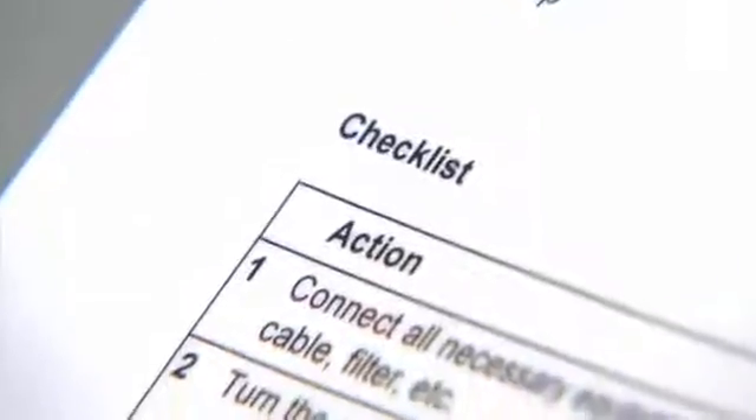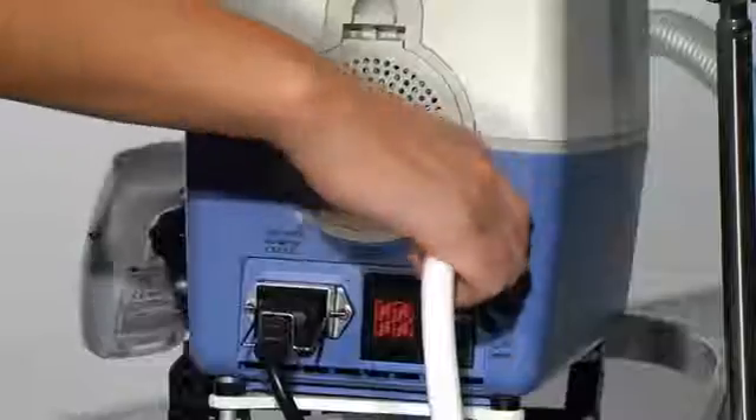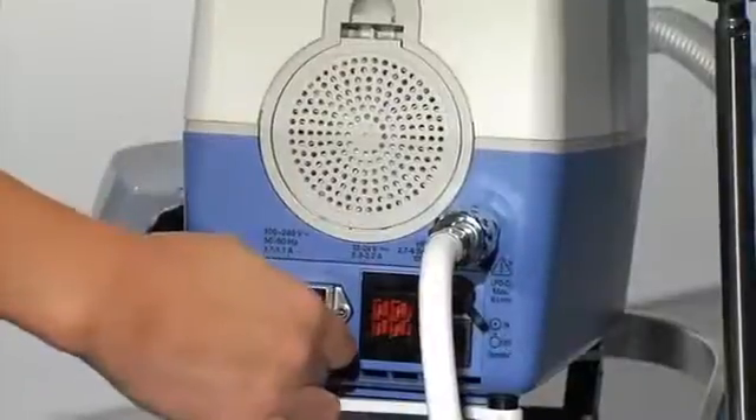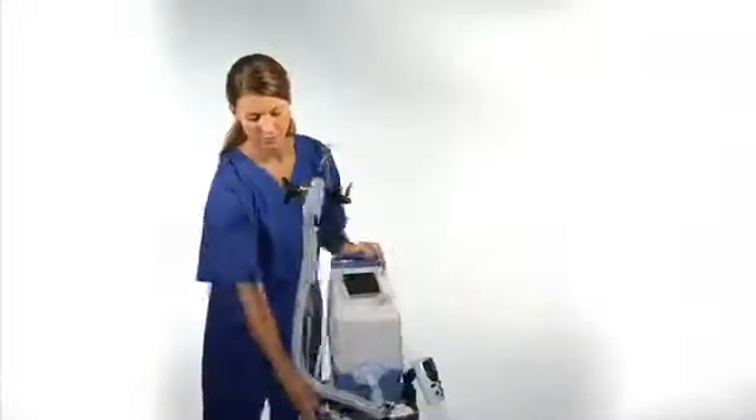The check includes the following steps. Make sure that all the necessary equipment is connected correctly, including the high pressure oxygen hose, power cable, HEPA filter, and bacterial filter.